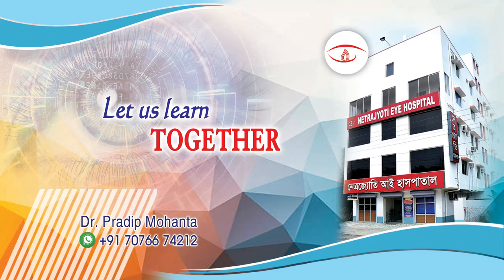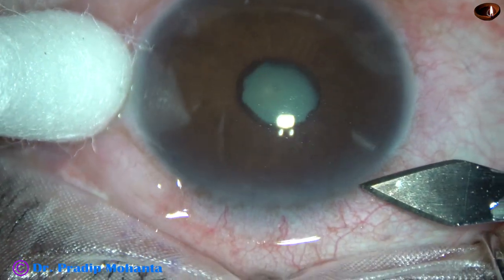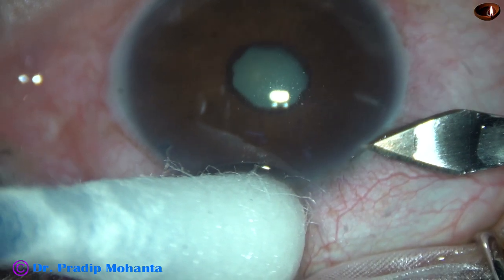Friends, welcome to my workplace at Ranaghat, West Bengal, India. This is a cataract with a very small pupil. Let us observe this surgery.